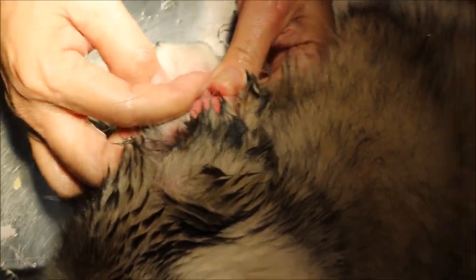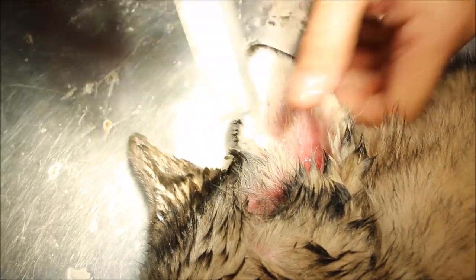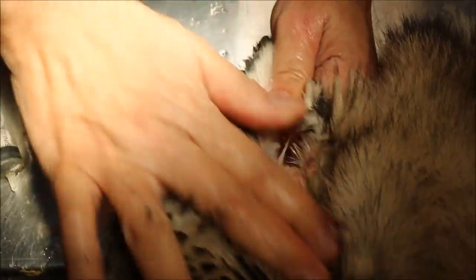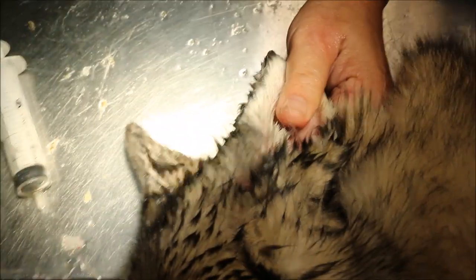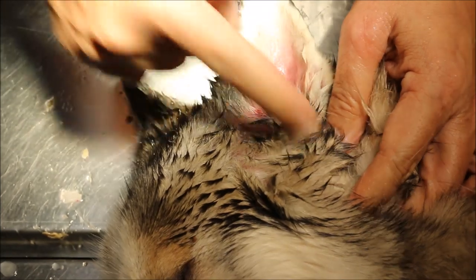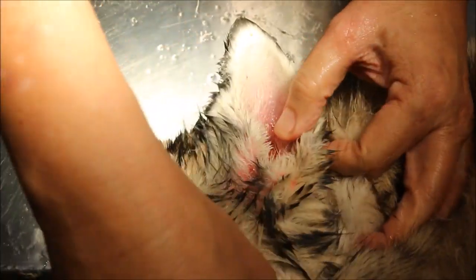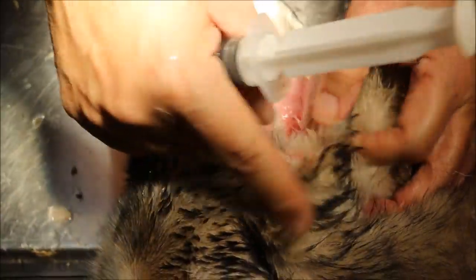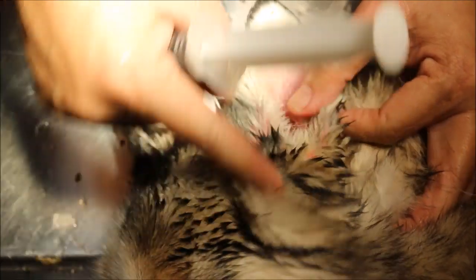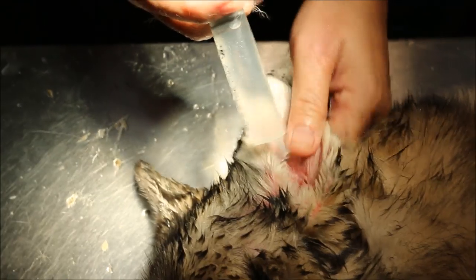You can't achieve 100% clearance in one session. After three weeks of medication and treatment, the plan will be to do a lateral ear canal resection — cut out the rectangular piece of cartilage wall here, so the entire vertical canal is opened up. I'm going to finish this ear and then move to the other ear.